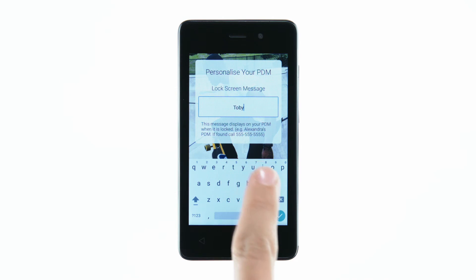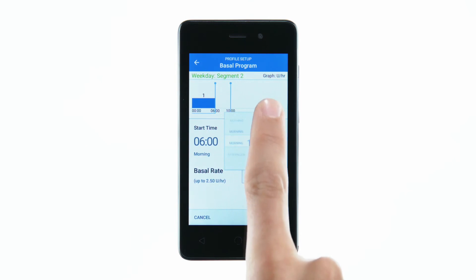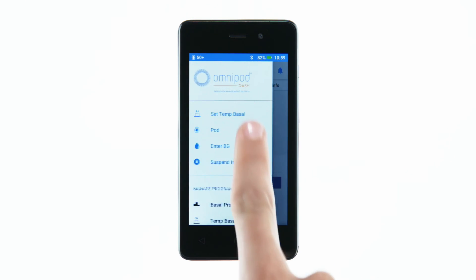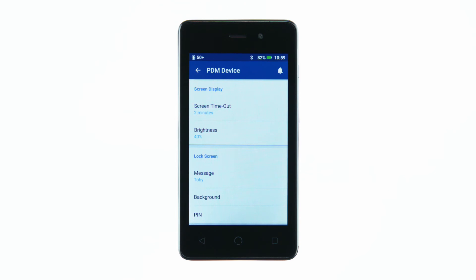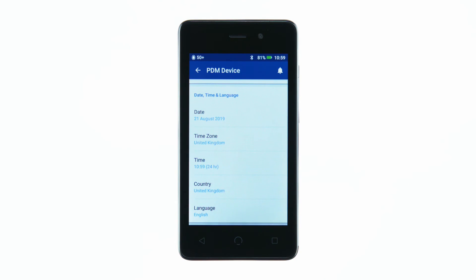All personalised PDM settings must be entered into the PDM before use. The PDM will keep a 90-day history of all blood glucose entries, insulin delivery, and any other actions that may occur. The PDM does not automatically adjust time, date, or time zone. Be sure to adjust your PDM's time for daylight savings, and if you are travelling to a different time zone, be sure to adjust the time zone setting.